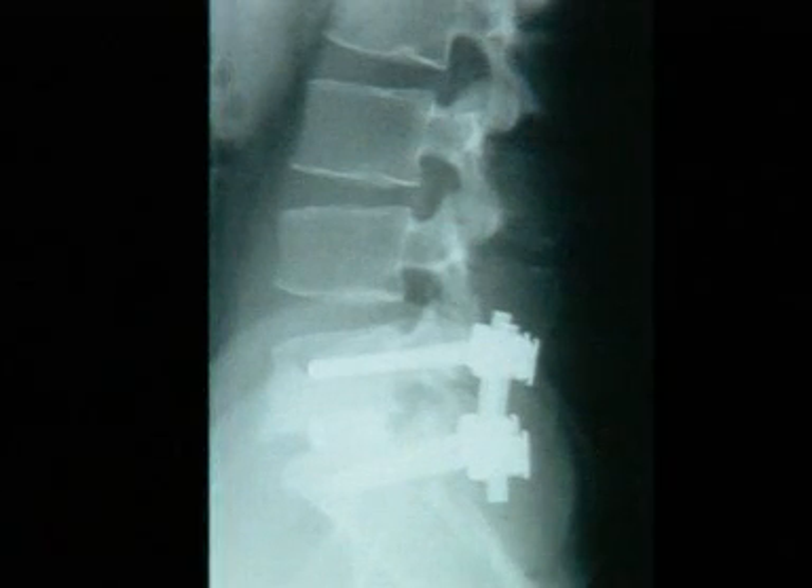The post-operative x-ray shows stabilization of L5-S1 using Cliquex and Contact Fusion Cages.